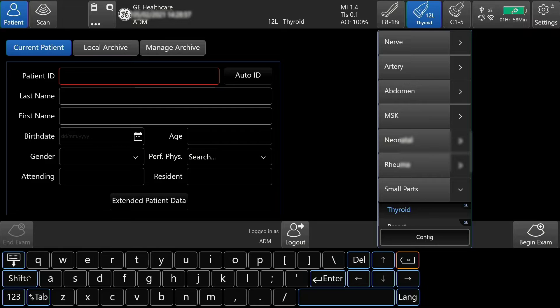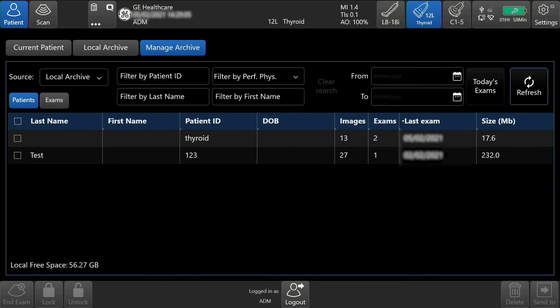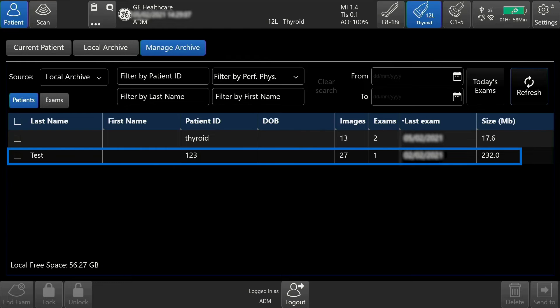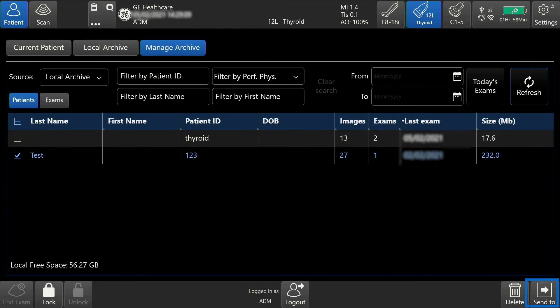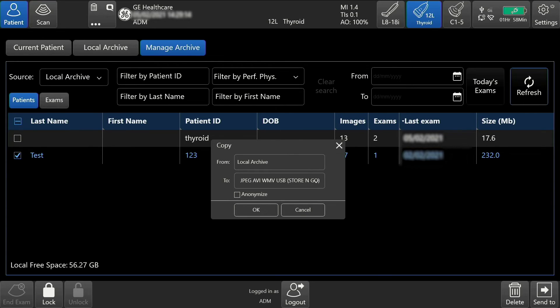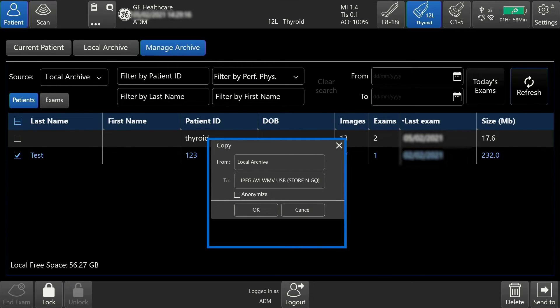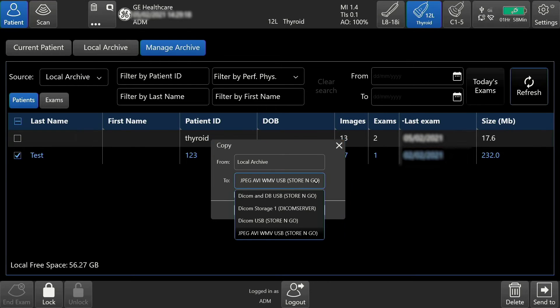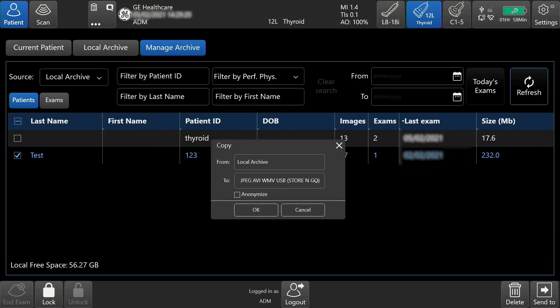To send one or more patient exams to an external device from the patient screen, tap Manage Archive. Tap the patient or patient exams, then tap Send To located on the bottom right-hand side of the touch screen. Select your destination with the drop-down arrow. If desired, you can anonymize the patient here.